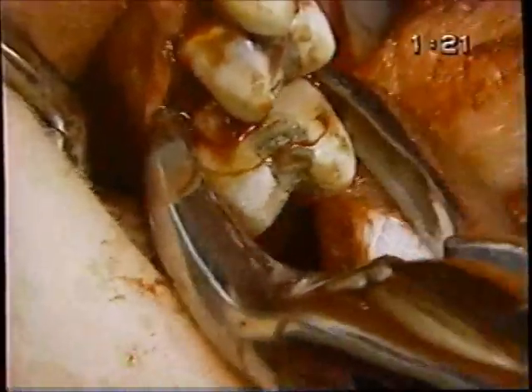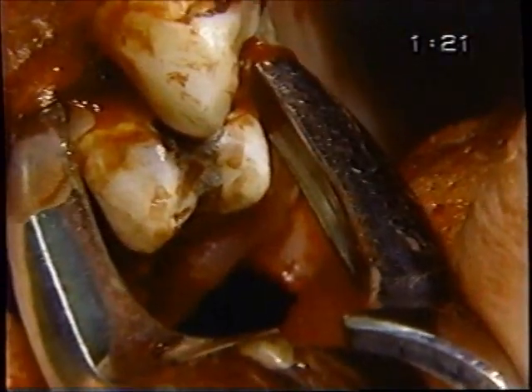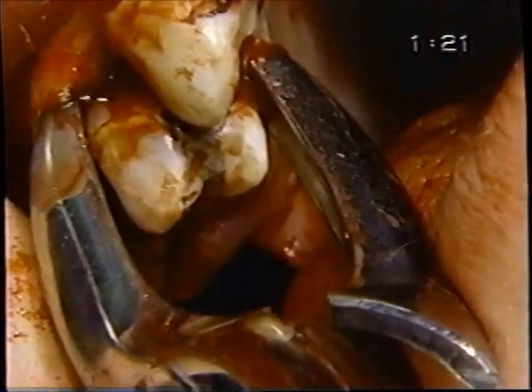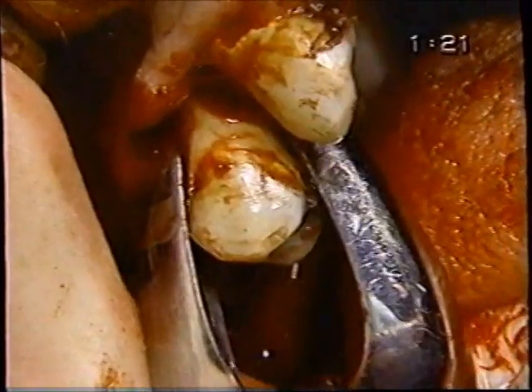Especially when we get to this first bi, I tend to lean more to the facial side, so that if there are 2 roots and one of them does happen to break, it will be the one on the facial, which is easier to get to, perhaps even with a fenestration. If we can't get the forceps on it without having it slip, since it's this far out, we'll just put it 90 degrees from the normal way, and bottom line is we get it out of there.